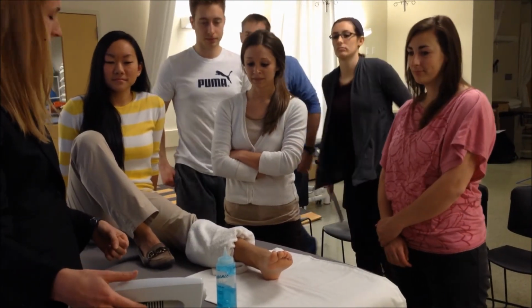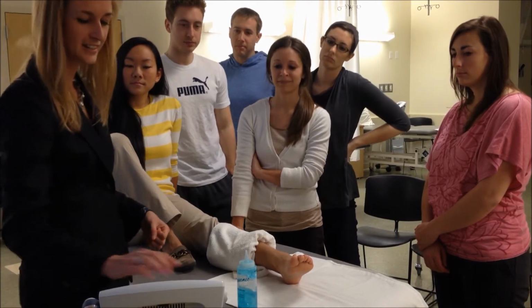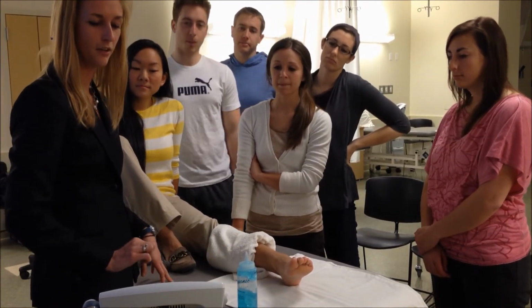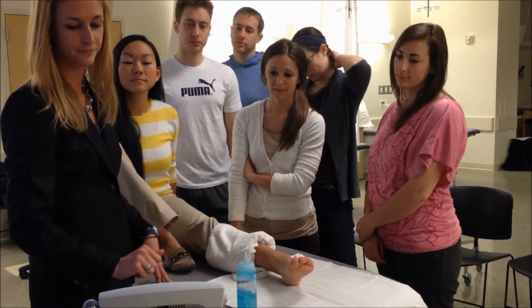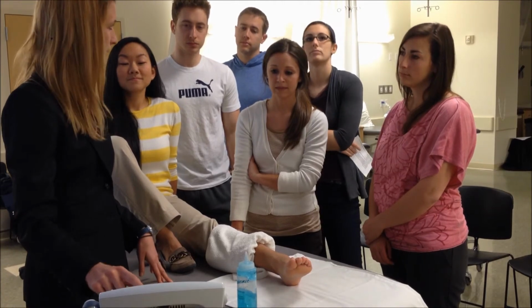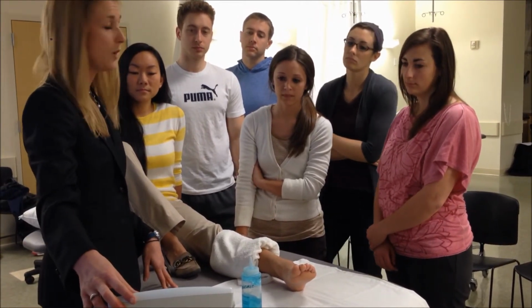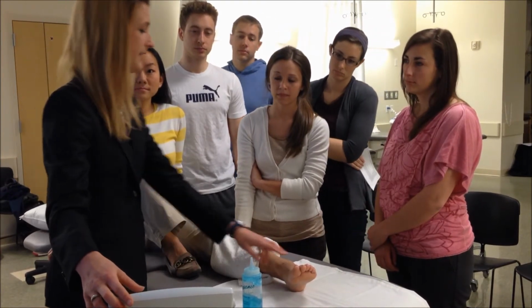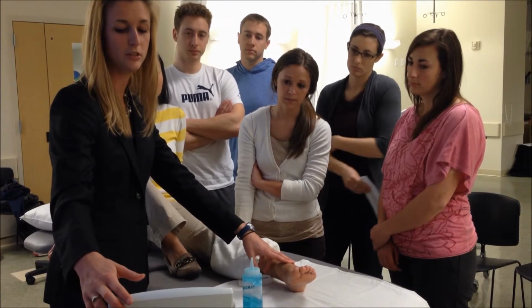All right, to turn this baby on, the power button's back here. Then it'll give you a list of different features. We're going to click on ultrasound. Okay, so edit right here. We want to edit the parameters. Push this button. All right, frequency right now is at 1 megahertz. We want to change that. The anterior talofibular ligament is pretty superficial, so we're going to change that to 3.